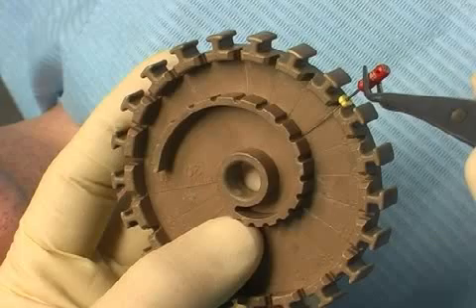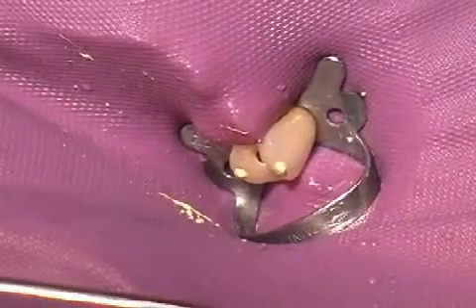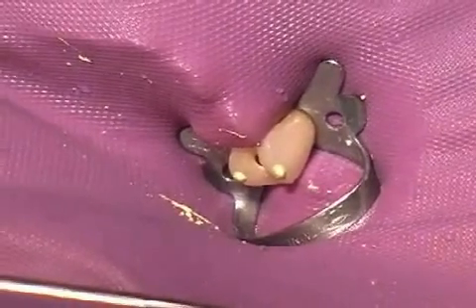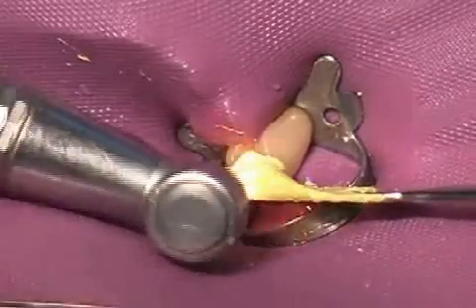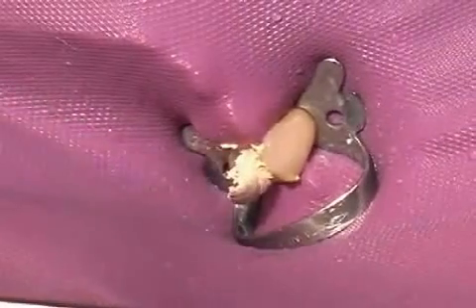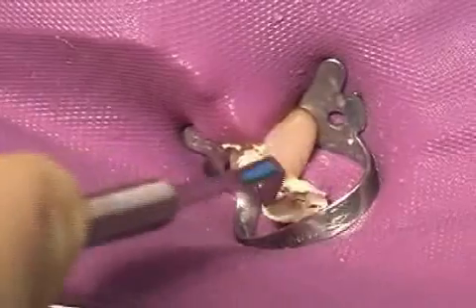If the tooth has a strong foul odor, if pain is experienced, or if there is severe bleeding from the interior of the tooth, then a final filling of the tooth's interior should not be done. In such cases, a medication — the yellow paste seen here — is rotated into the tooth, which is then tightly sealed for a couple of days. However, the temporary sealing material must be absolutely saliva-proof; that's the gray compound seen in the image, which keeps the tooth tight for about one week.